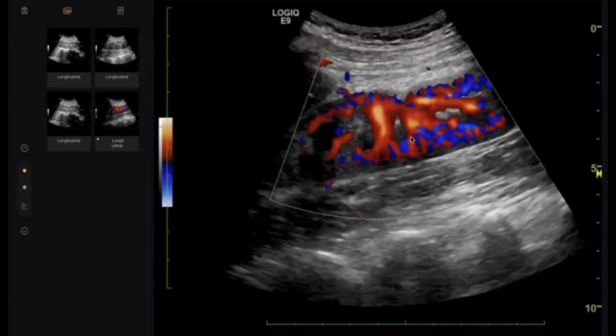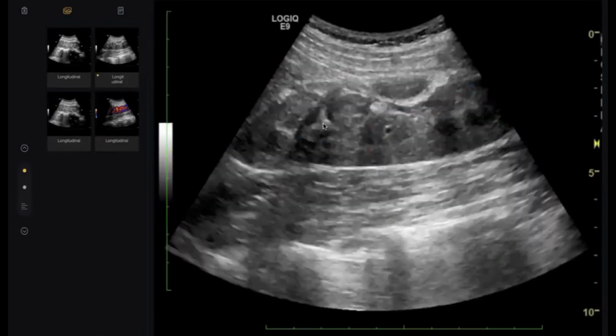Where is anterior from here? This is the vertebral column. Yes, so this is the anterior: skin, subcutaneous tissue, it's superficial. And this is the muscle, and then the spine. What about the orientation of the pelvicalyceal system? The hilum is rotated anteriorly.